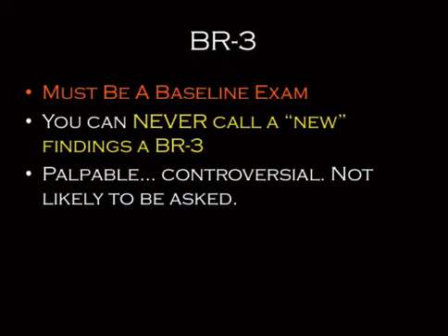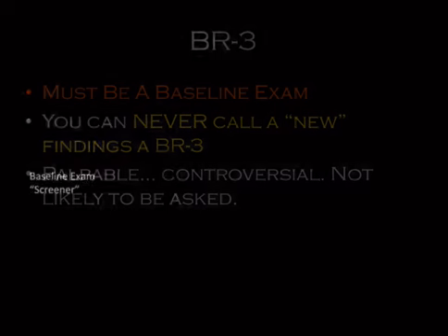You can never call a new finding a BR3. Anytime you use that, and there's only 3 specific scenarios when you can, it must be off of a baseline exam that then gets called back. So, baseline screener exam, you're always going to BI-RADS 0 it. It's going to get a diagnostic workup, and then you can call it a BI-RADS 3.